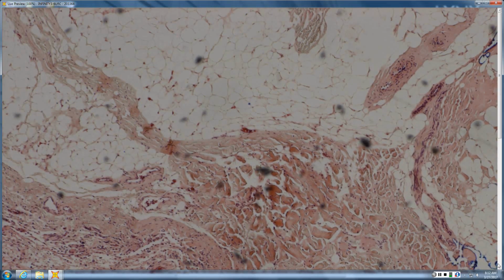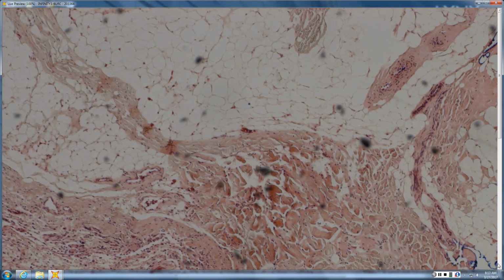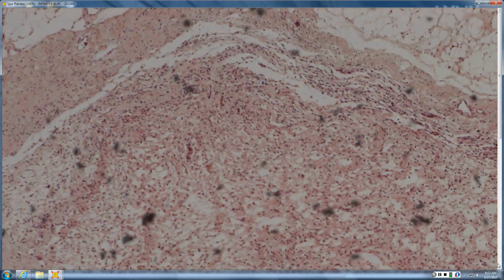Yeah, like a rudimentary meningocele. So rudimentary meningocele tends to, the meningothelial cells wrap around things, wrap around collagen, form an angiosarc-like pattern dissecting between collagen, and sometimes they're more neuroid, myxoid, almost NF-looking areas.